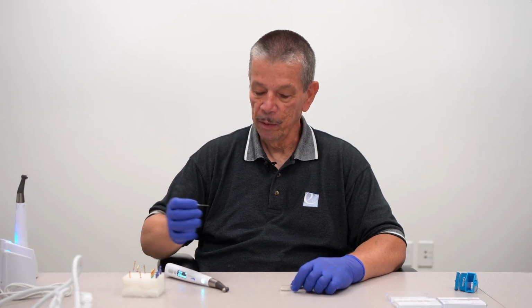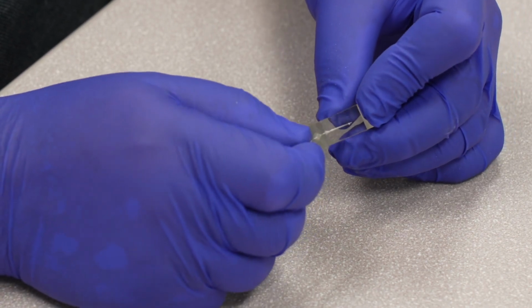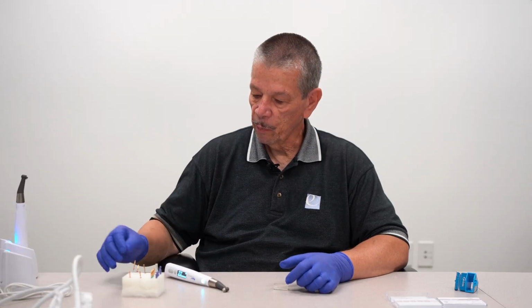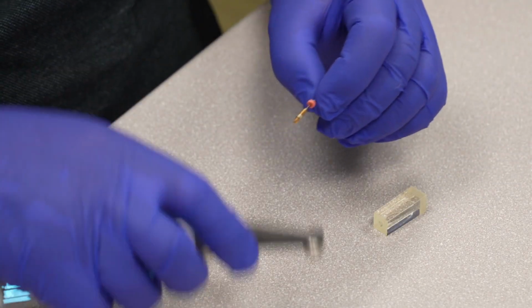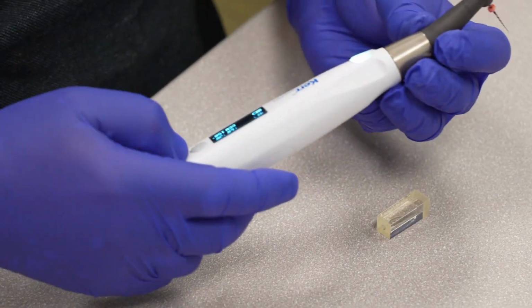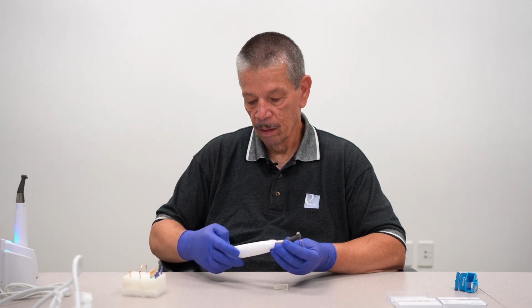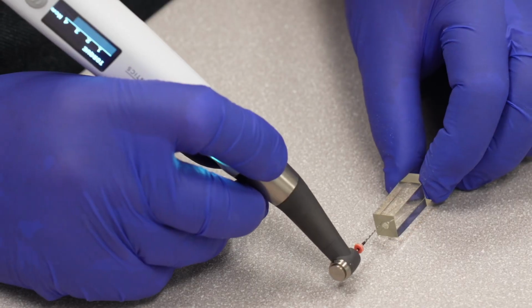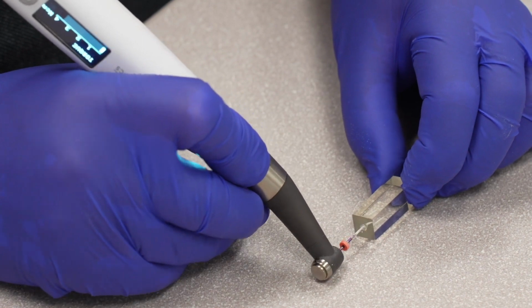ZenFlexONE IFU. So we're going to negotiate the block, make sure that we reach the apex with a size 10. And we're going to take our Traverse glide path file, and we're going to put it on the Traverse motion, which is standard rotary. And we're going to negotiate the glide path to the apex.